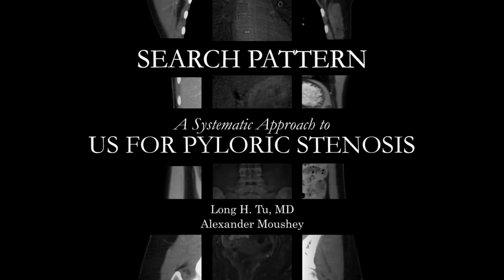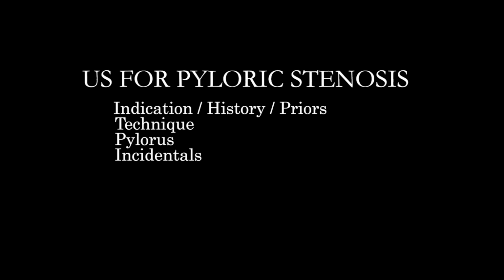So today we're going to talk about a basic approach to ultrasound in pediatric patients for pyloric stenosis. Ultrasound is the imaging modality of choice, and it's essential to have a sense of not just the diagnostic criteria, but also how to troubleshoot some issues that may arise as you're actually doing the exam.